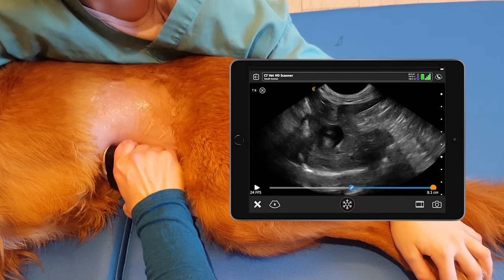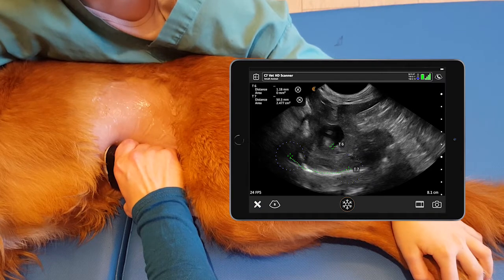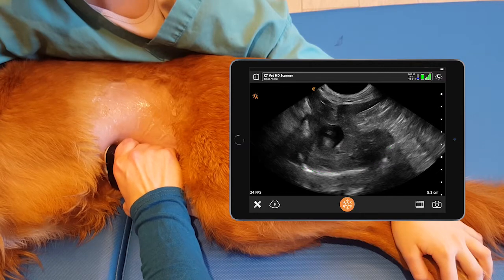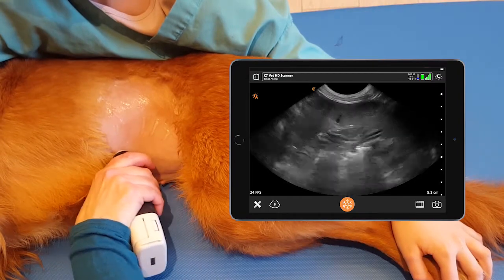Here we can see the gallbladder, and we can see the hyperechoic line of the diaphragm. We fan all the way through cranially and all the way through caudally.